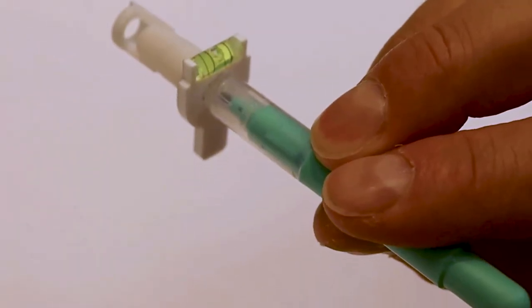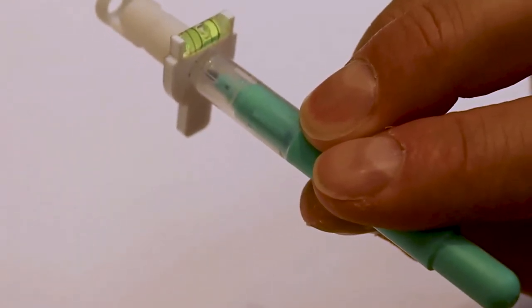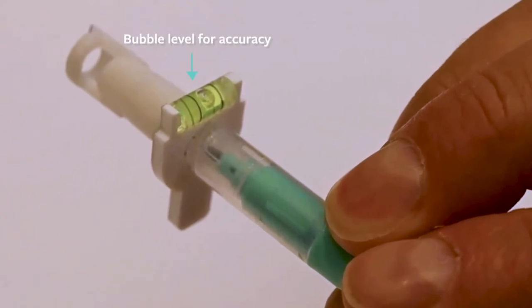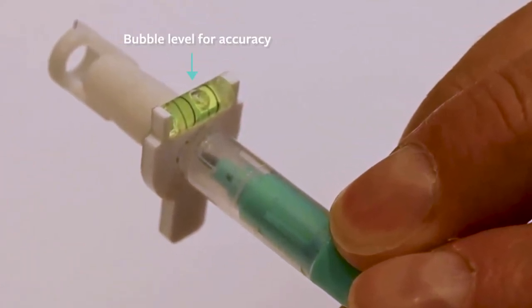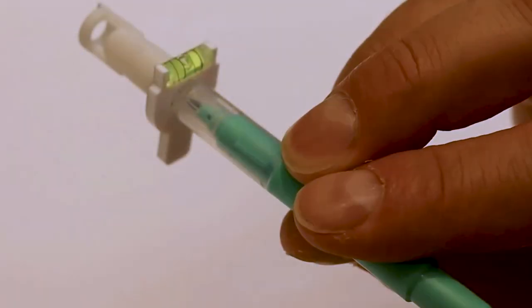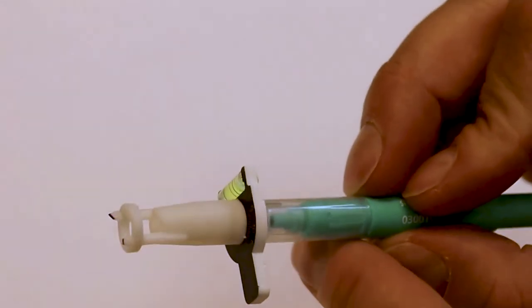As you approach the patient use the bubble level to ensure that your axis markings will be accurate. You hold the device a few millimeters from the patient's cornea centered on the cornea and then you gently move the device forward. Apply your marks to the cornea and then the device can be disposed.